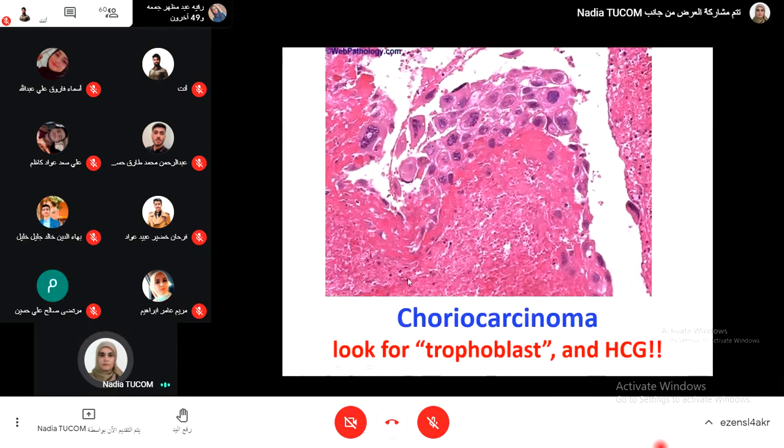Choriocarcinoma. Guys, this choriocarcinoma is more common in this tumor. When you hear chorio, what does it mean? It means placenta, right? Trophoblast, cytotrophoblast, trophoblastic tissue, also secreting beta HCG, which is always a tumor marker in the serum and in the tissue also. Areas of necrosis and bleeding are very common. The cells are bizarre, large, atypical, pleomorphic.